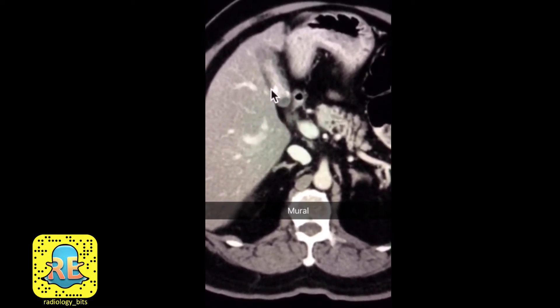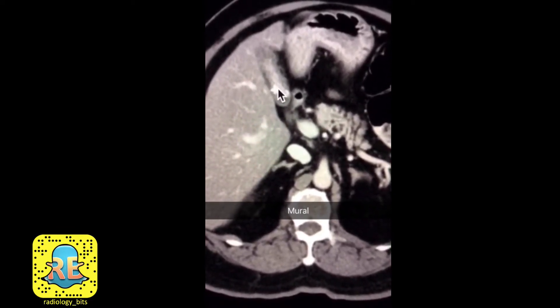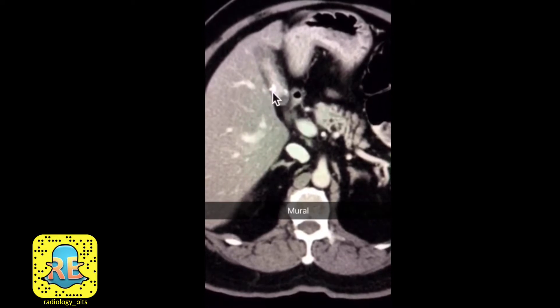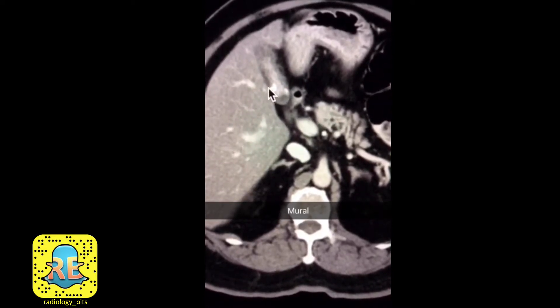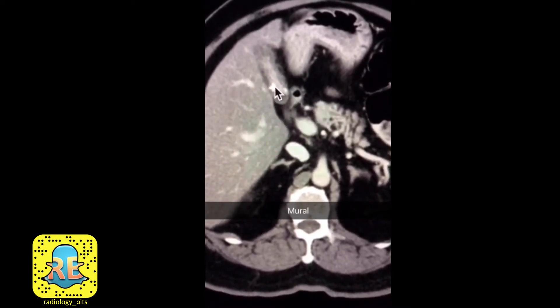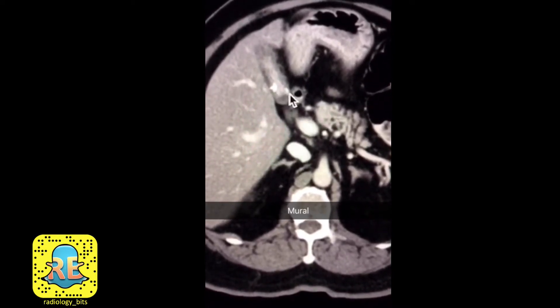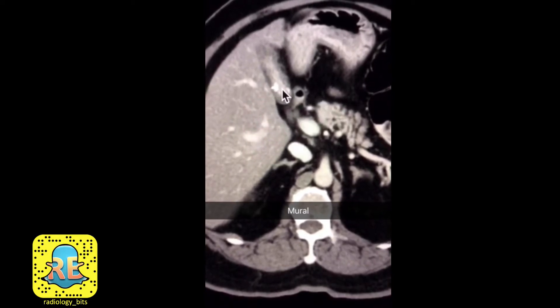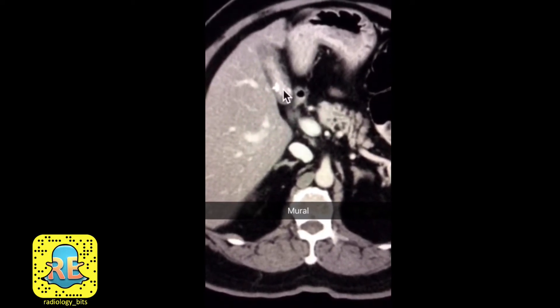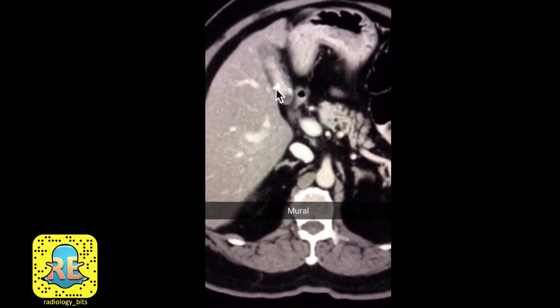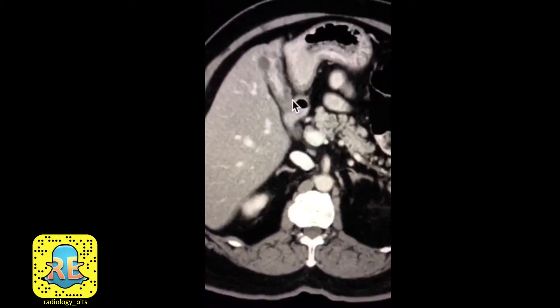The wall itself contains dense areas consistent with calcifications here and there. The calcifications are not within the lumen, so they are not gallstones. These are mural calcifications.